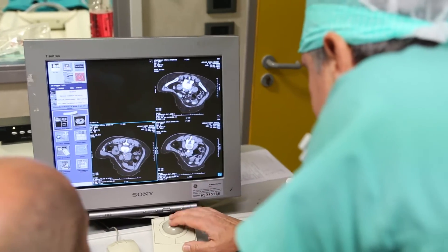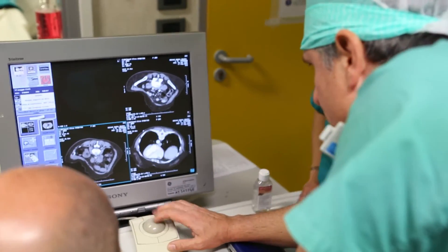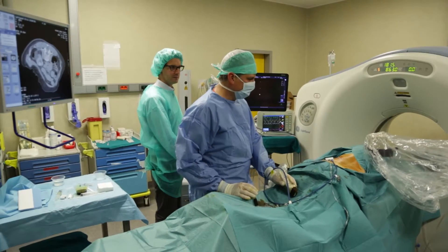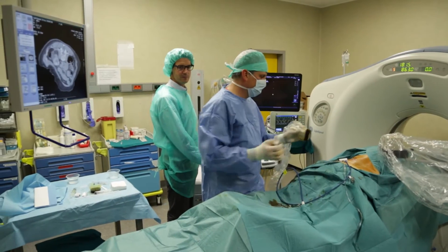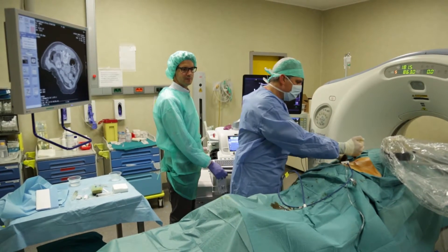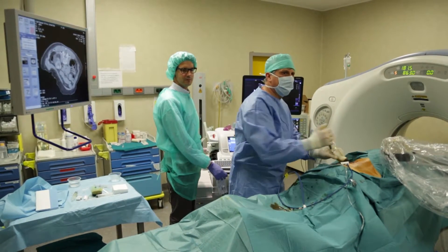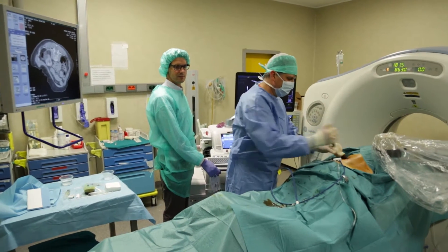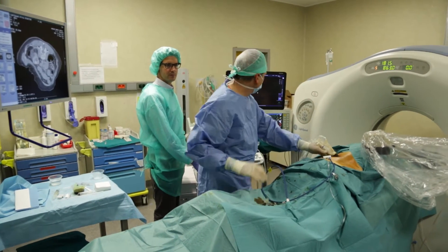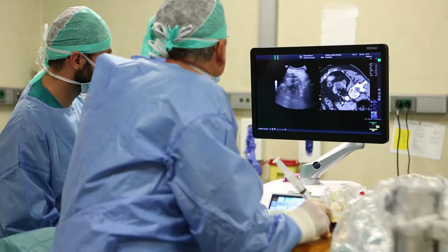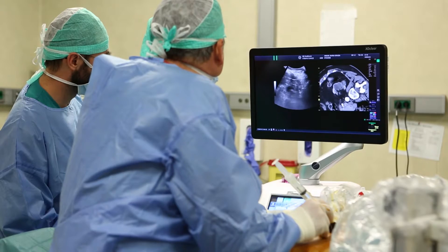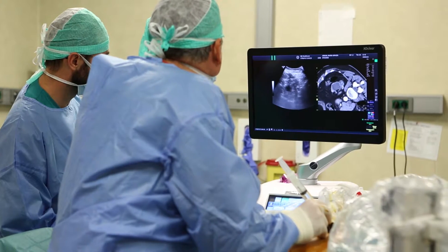Even complicated procedures can be transformed into easy ones. We can see the needle path on our screen thanks to the imaging technique. With this technology we can now do things quickly and efficiently — it is now less complicated.